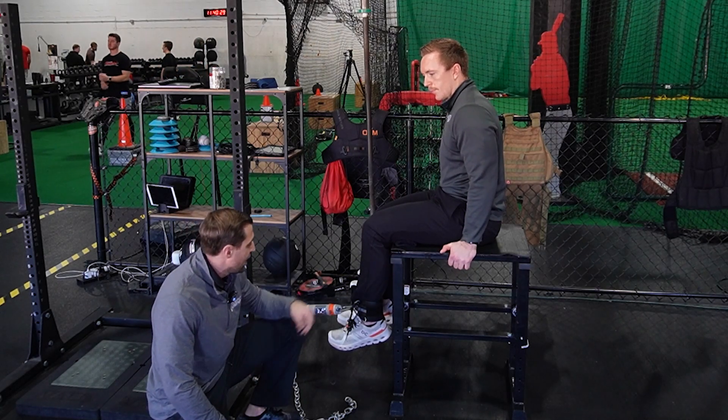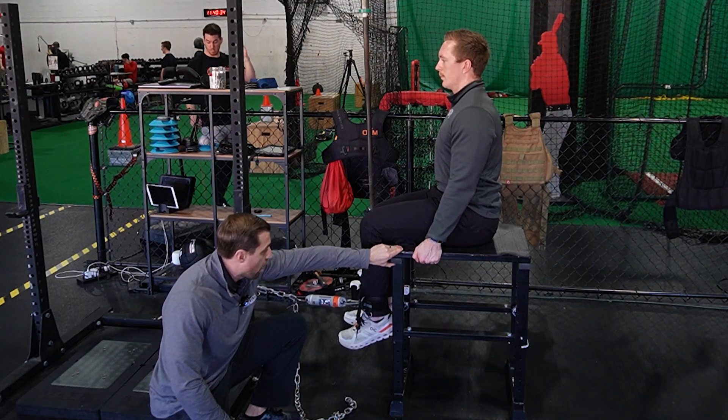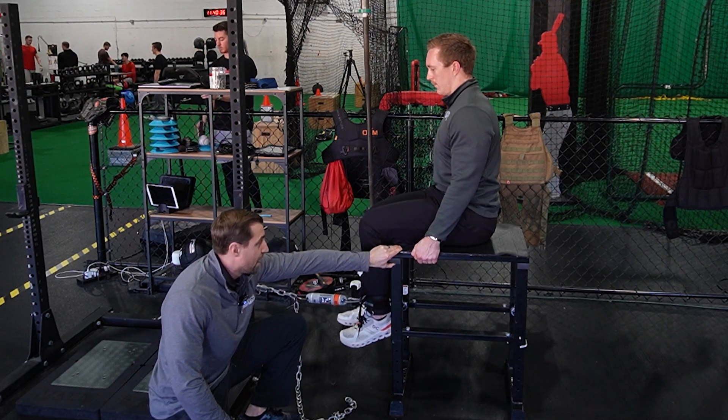If you're measuring rate of force development for the hamstring, take the slack out of the chain, then push as hard and as fast as you can. Three, two, one — push, and then relax.